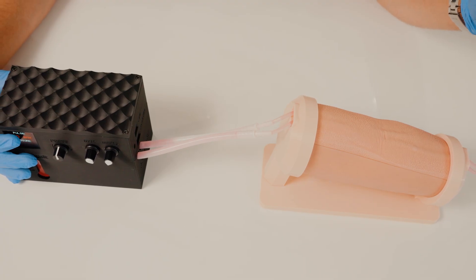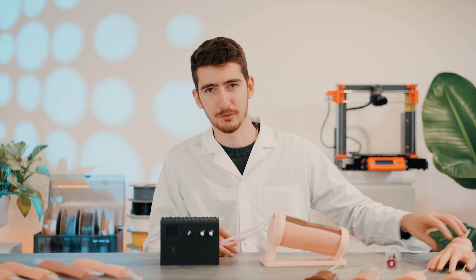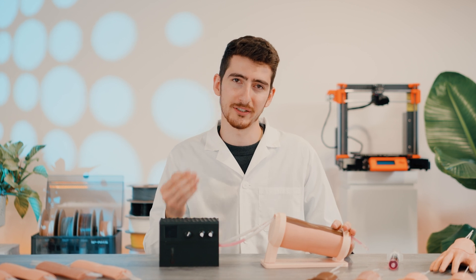It pushes the blood through our mini puncture and our cannulation models, and gives you real-time feedback.